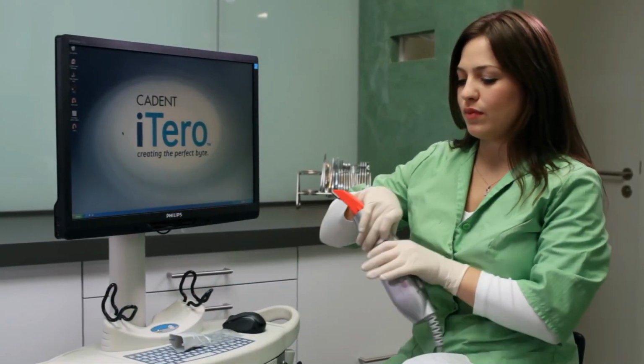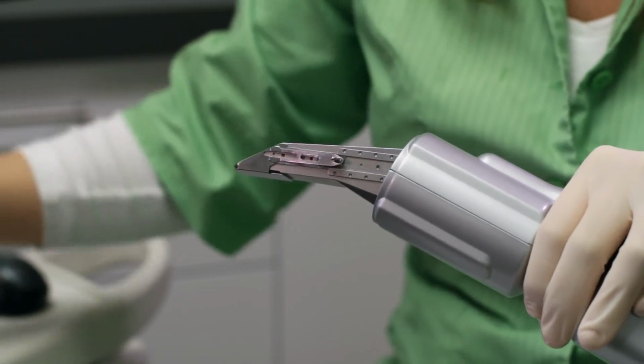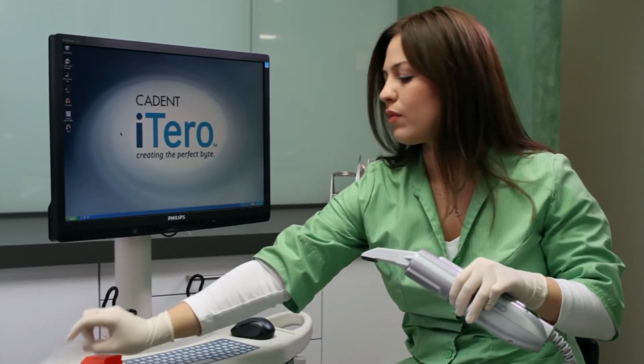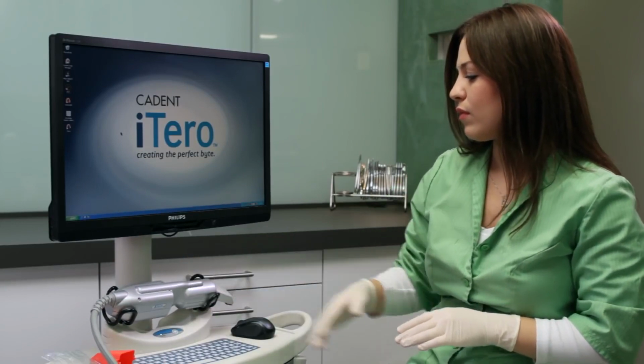First, remove the cover sleeve on the iTero scanner. Press on both sides of the sleeve to release the cover. Attach a brand new, single-use disposable sleeve. Make sure that the sliding cover lines up with the sleeve so that it snaps into place.